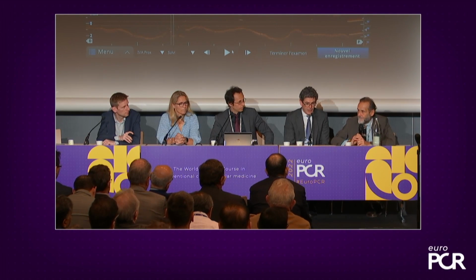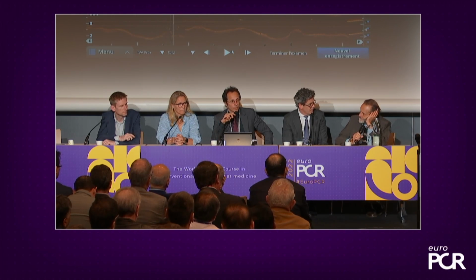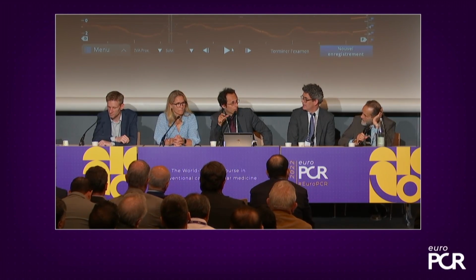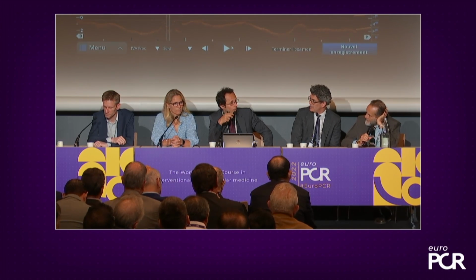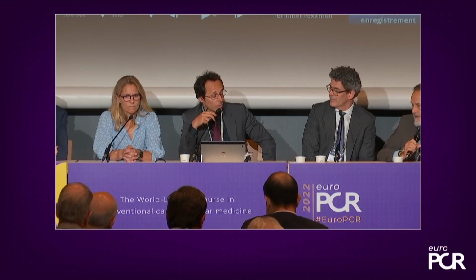Absolutely. And I think we'll see, as we increasingly treat nodular and eccentric calcium, that you may have to apply a lot more shocks at those segments. There's still also the recommendation of the company to use 2 runs at the same spot, correct? Sure. Do you think why it is like that? As you have seen here, with the first 4.0 balloon, the effect was there. So do we need more modification at this spot, or should we just modify the whole plaque?